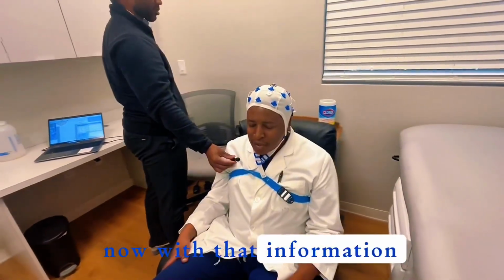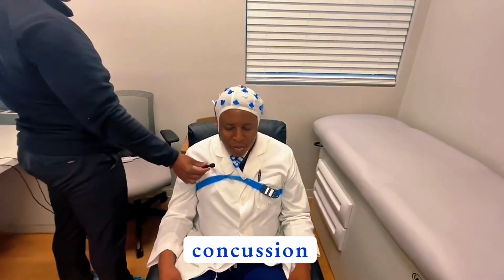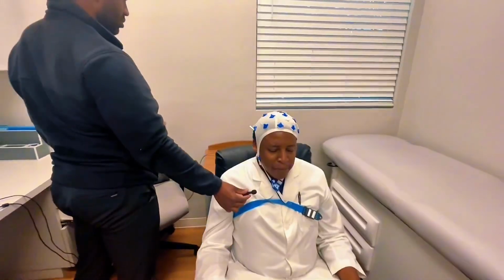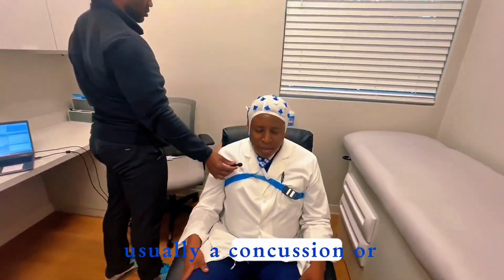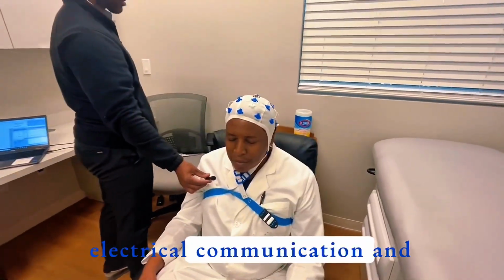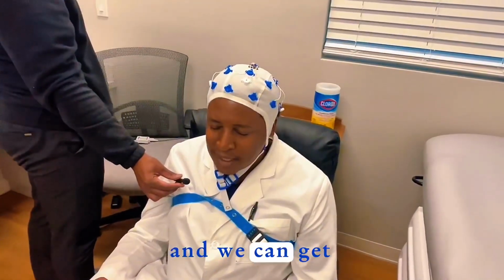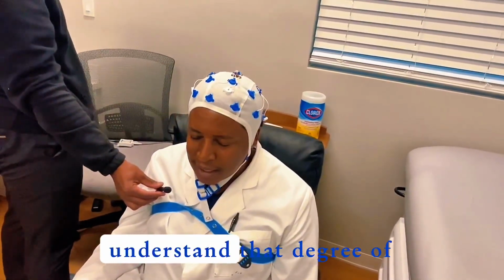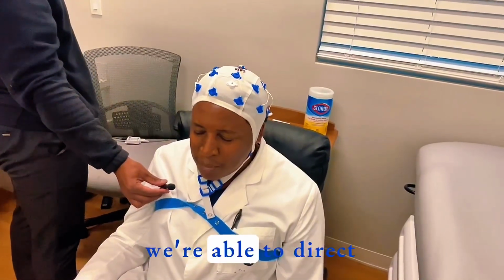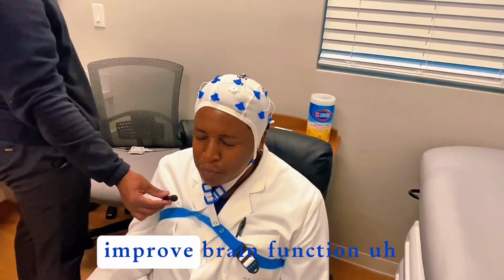Now, with that information, especially in patients with brain injury like concussion and across the spectrum of brain injury, that information is important. Usually, a concussion or a brain injury will result in disruption in brain electrical communication. And we can detect that using this QEEG test, and we can get a brain map to understand that degree of disruption. Now, once we have that understanding, we're able to direct certain forms of treatment towards the brain to try and help improve brain function.